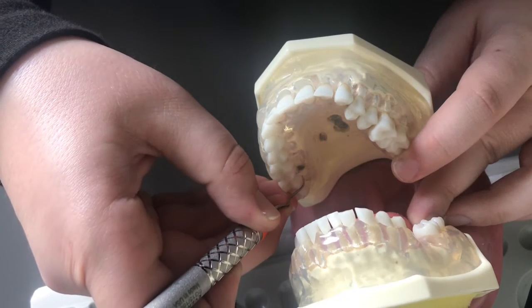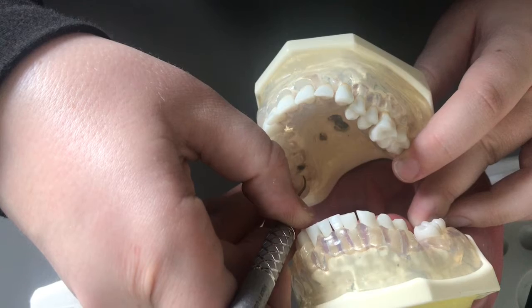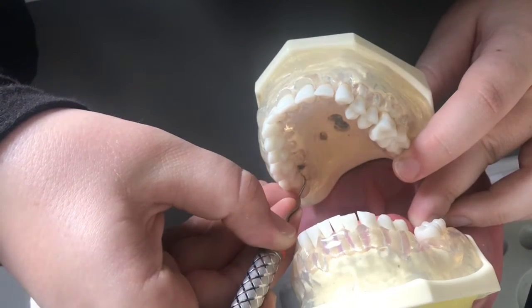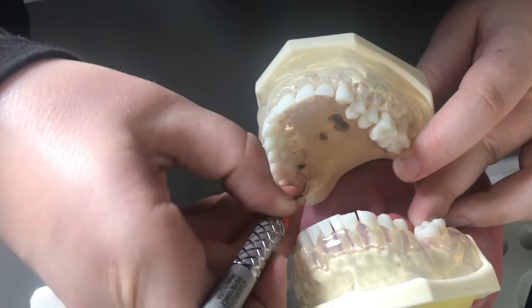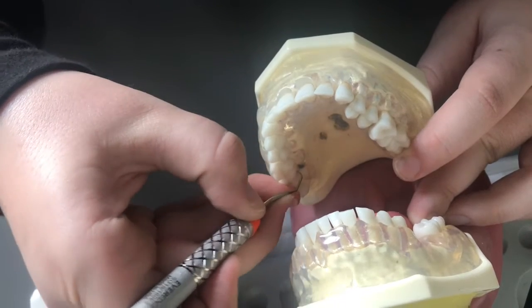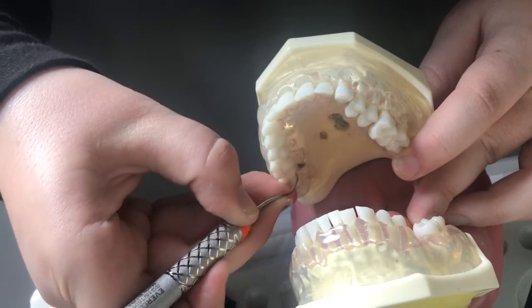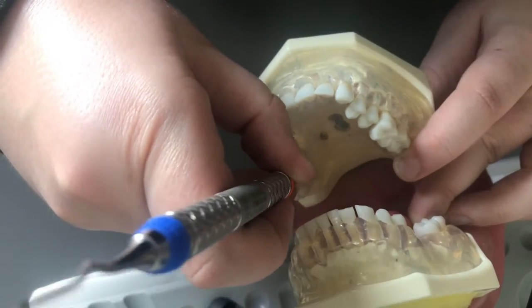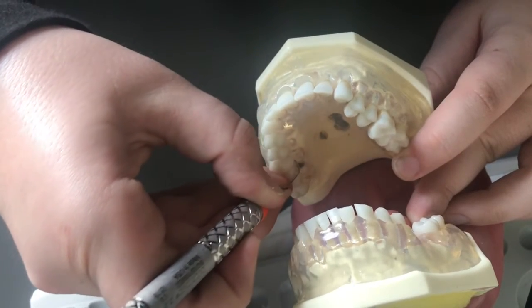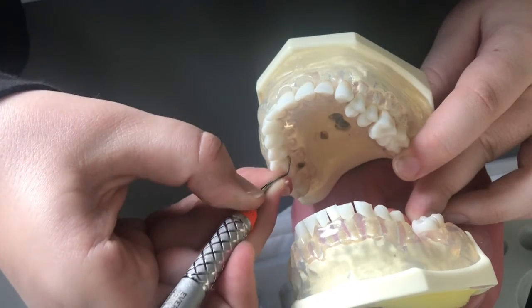When I go into the sulcus, I have my blade at 0 degrees, and then I'm coming around, rolling my instrument and getting into the interproximal space and coming out. And I'm just going to repeat that on the remainder of the right maxillary lingual.